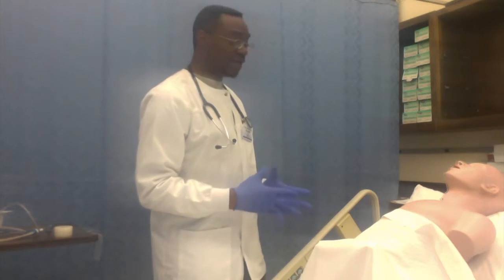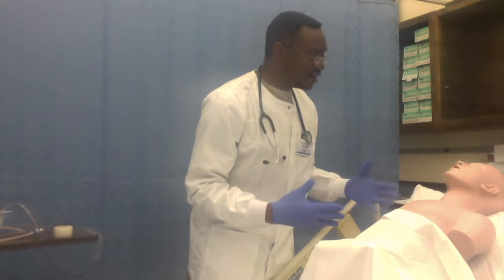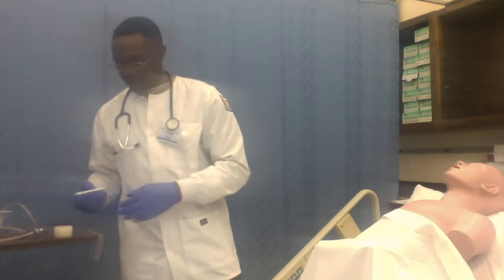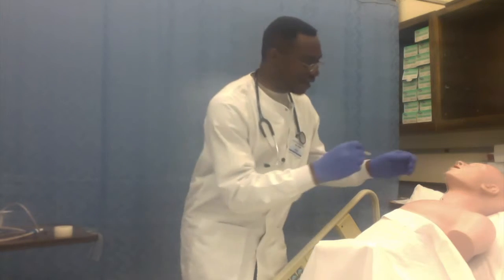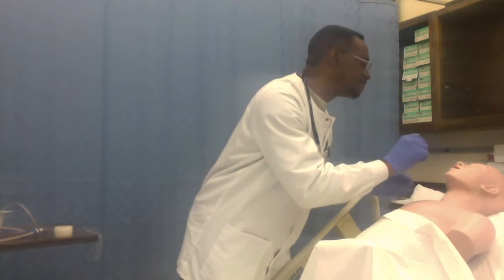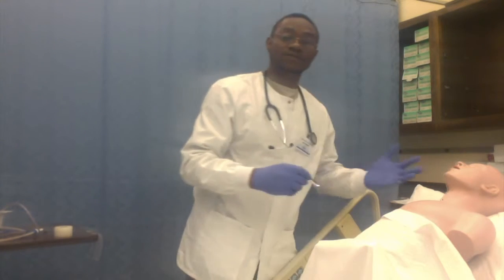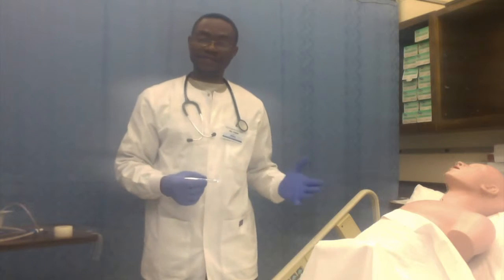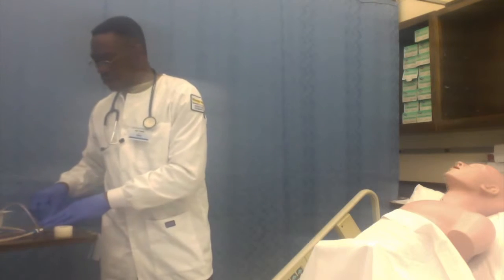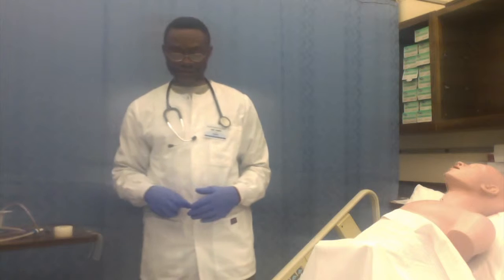Having done that, I will further ask the patient if he has had any nasal surgeries lately. I will also inspect the patient's nostrils to see if they are patent. I might also want to find out if there are any lesions in there that might hurt him during the procedure. But given that everything is okay, I will proceed with the procedure.